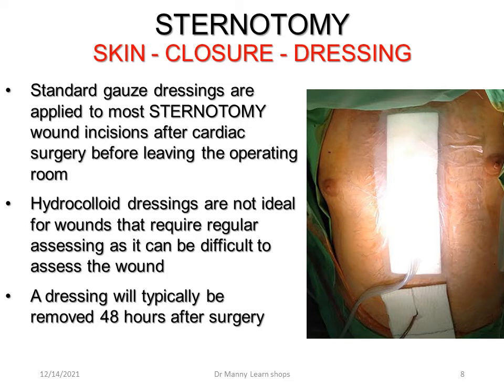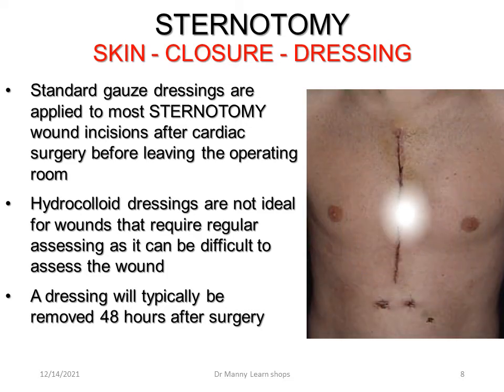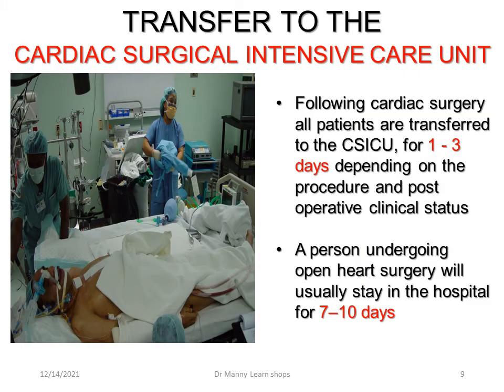Sternotomy, skin closure, and dressing. After which, the patient is transferred to a cardiac surgical intensive care unit.